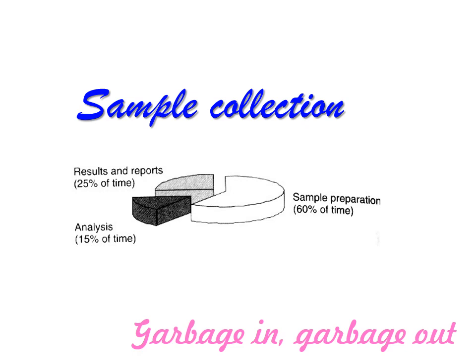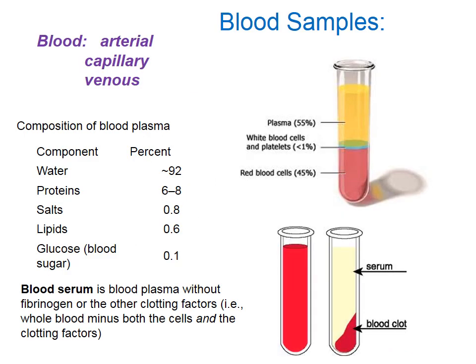So we'll quickly look at sample types, to start with. Of course, in the ideal case, you can find pure poison somewhere outside of the human body and then identify it as quickly as you can. But this luxury doesn't happen often.